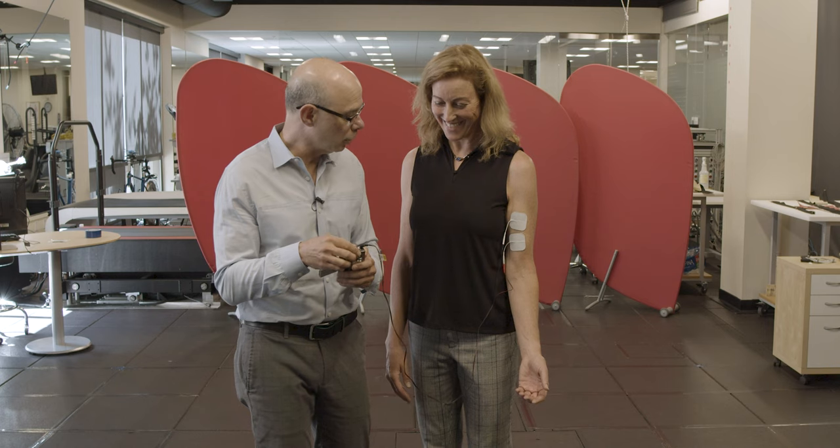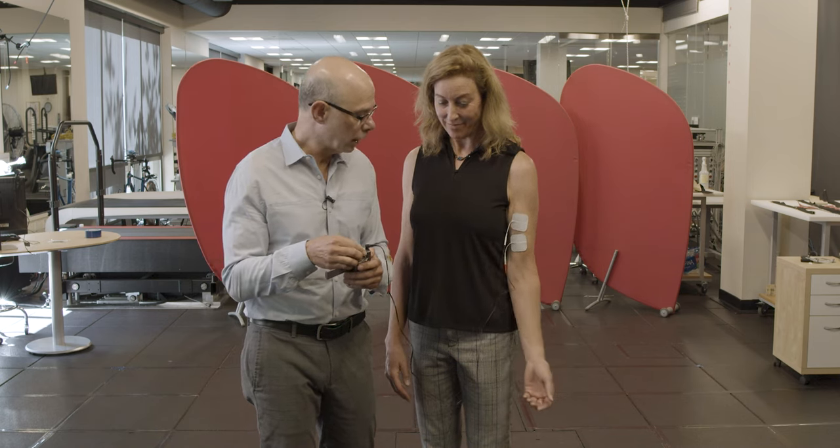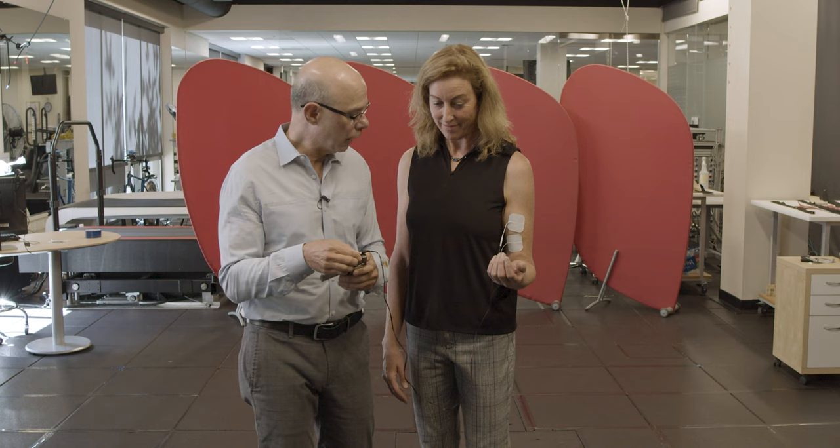I'm going to turn it up just a little bit. She's just relaxing — just relax your arm. I'm going to turn it up. And so now I can move her arm for her. I'll turn it back down. So that's involuntary contraction with electrical stimulation.